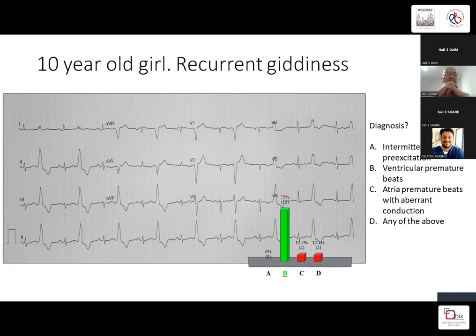So outflow tract tachycardia is one of the benign tachycardias seen without any structural heart disease, and that is amenable to ablation. So here we have a bigeminal pattern. You do see a relatively narrow QRS. It's broad, but it's relatively narrow. It is negative in V1, meaning it is an LBBB type, so it may be arising more from the right ventricle, and the inferior leads are positive. Okay, so we are in the RVOT. Most of you are right. Next, we'll move on to the next one.